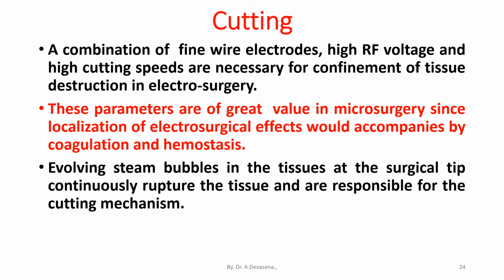Evolving steam bubbles in the tissues at the surgical tip continuously rupture the tissue and are responsible for the cutting mechanism. Here is a representation for the cutting process.